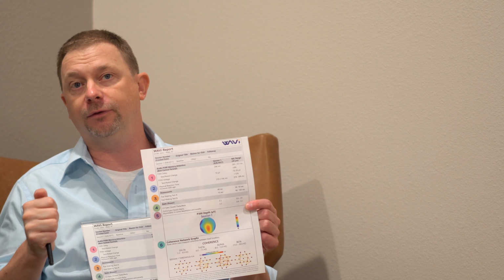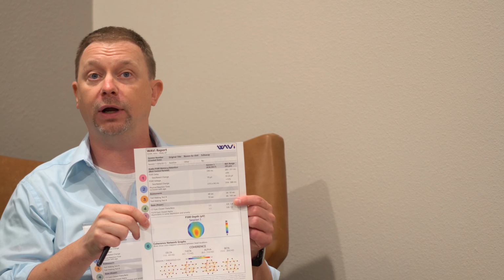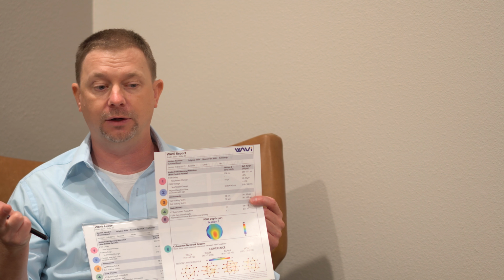That is very telling for us to figure out what's going on with your brain, if it's very healthy or if it's had some slowing in reaction to both cognitive and physical scenarios. Whether you're in sports and you want to have good reaction time, not just simple reaction time, like a reaction where you flash a light, but a more complex reaction time, where you're discerning a relevant stimulus from something around you that might be noise.